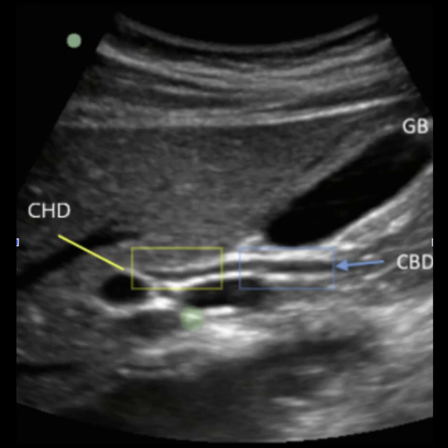After imaging the gallbladder, the next step will be to look at the biliary tree. Ultrasound can be used to see the common hepatic duct and the common bile duct. These structures are continuous with one another, but are differentiated by the porta hepatis. The common hepatic duct should be surrounded by liver and anterior to the portal vein. The common bile duct is outside of the liver and is also anterior to the portal vein. The common bile duct can be seen running all the way to the pancreas head.